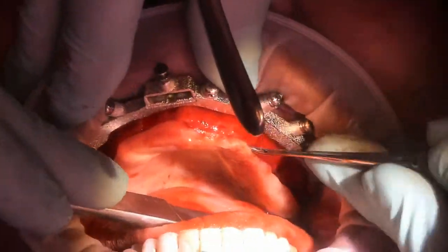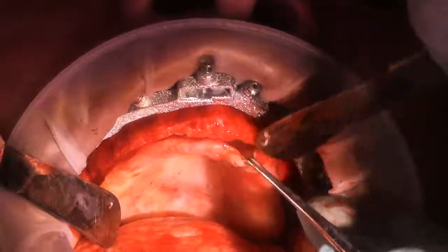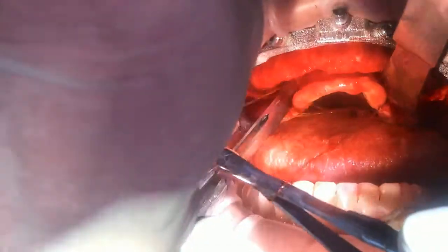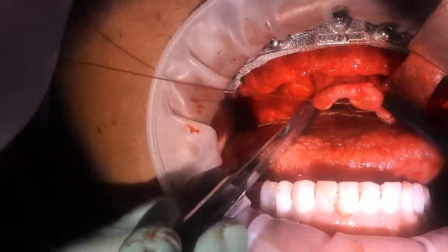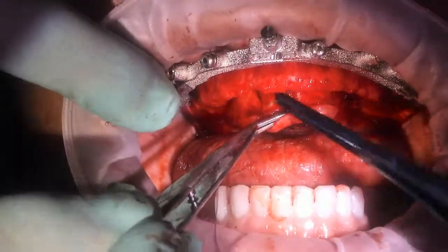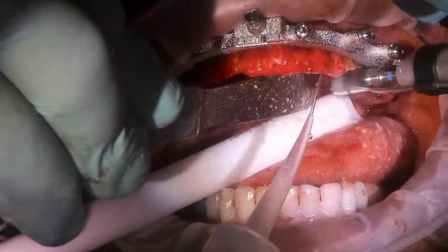Once the fixation base is seated, the rest of the chrome surgery follows all other chrome surgical protocols, which is reduce the bone to the level of the fixation base. And I know a lot of doctors tie off the lingual tissue with a suture, and then of course perform all the bone reduction.